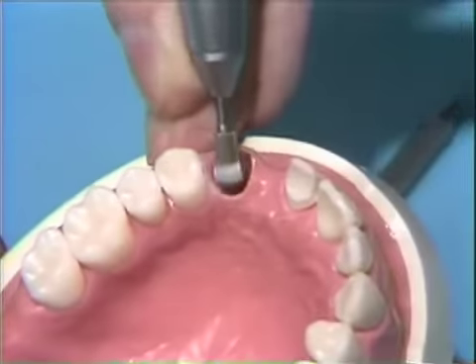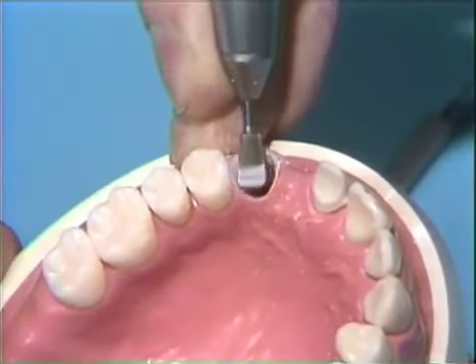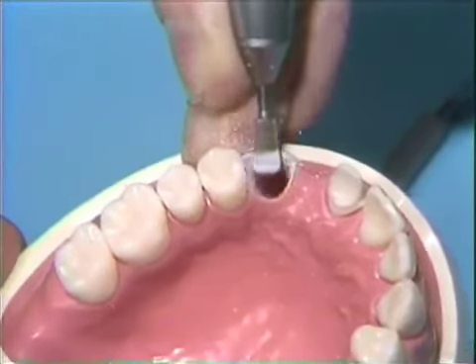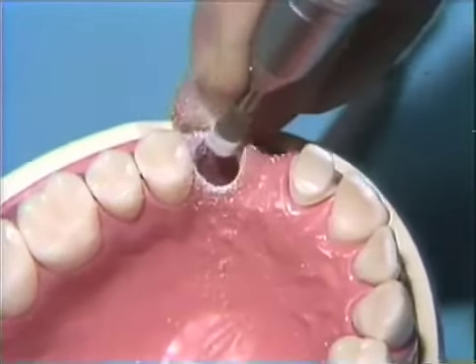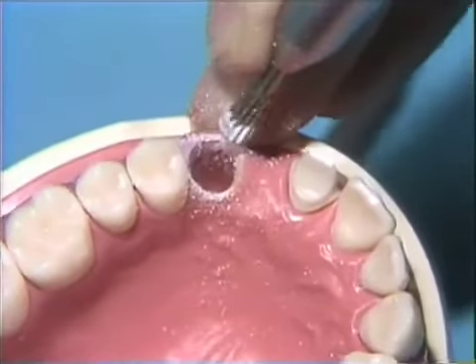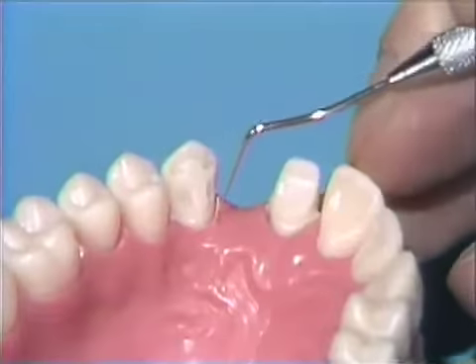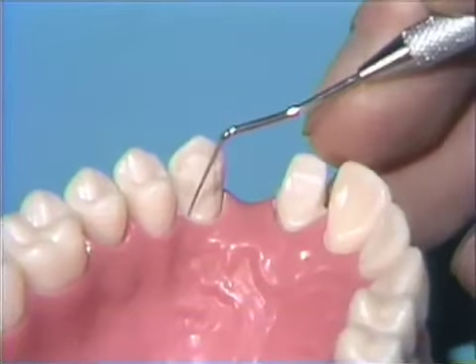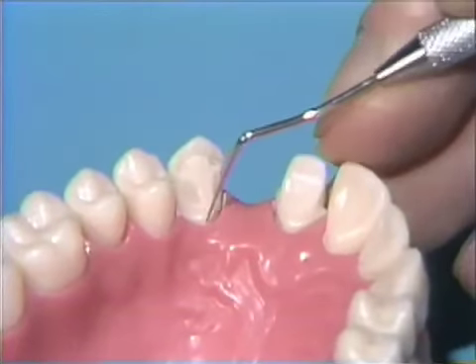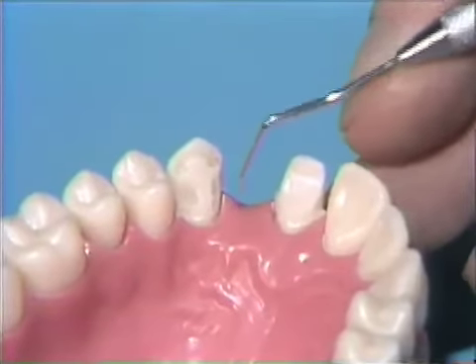And also over on the other side. Notice that we've preserved as much of the edentulous ridge as we could, and we're about ready to start again and prepare our pinholes. We've now relieved the cuff of gingiva in this area, similar to how in the mouth we'd be placing retraction cord in this area, leaving it dry for a period, then displacing the sulcus. Now we're ready to take this impression of this tooth.